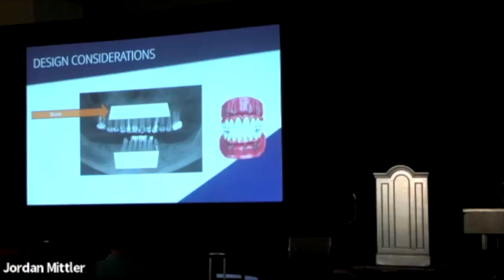And so that's very basic thinking. We try not to do complicated bone grafting procedures like we used to. You'll notice that in the mandible, it starts at the apices of those lower incisors. Everything coronal to the apex of the lower incisors, we call that the junky bone. That's the thin bone. It's really not very valuable. It's what's underneath there. That's the meat of the rest of where we want to put the implants.